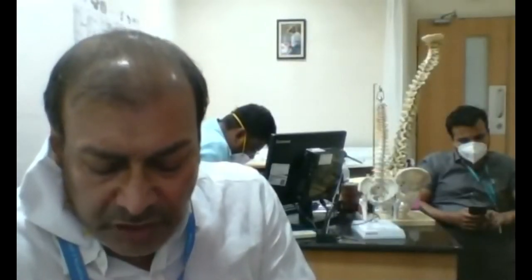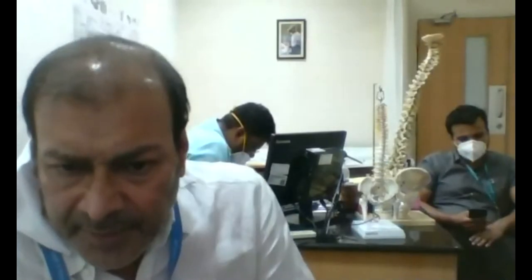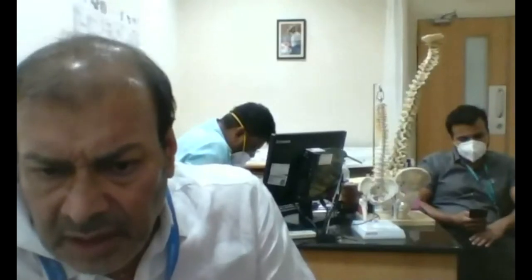We do it with our neurosurgery colleagues, and we do it with a high-powered microscope, but invariably there are tears there, invariably. You have to expect dural tears, which are difficult to suture and which you need to patch up. And pneumocephalus? That we haven't seen. Okay. Ajay? Thank you.